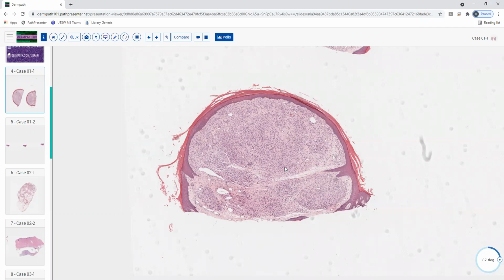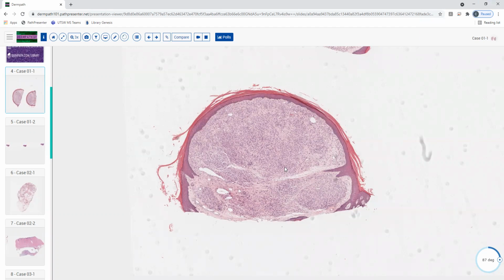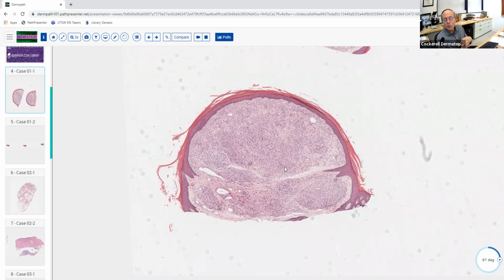This looks like a neoplastic process that involves primarily the dermis. Good. And we've got some dilated vasculature in there, but predominantly it's sheets of whatever these cells are. We're having a tough time telling exactly what kind of cells they are, but we're going to work through a little algorithmic approach. So if we think it's a neoplasm, what's the most important thing about neoplastic diseases?